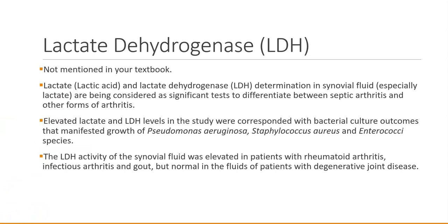Lactate dehydrogenase, or LDH, levels are not mentioned in your textbook, but as I did my research in a lot of different publications, they showed LDH as a frequently ordered test on synovial fluid.